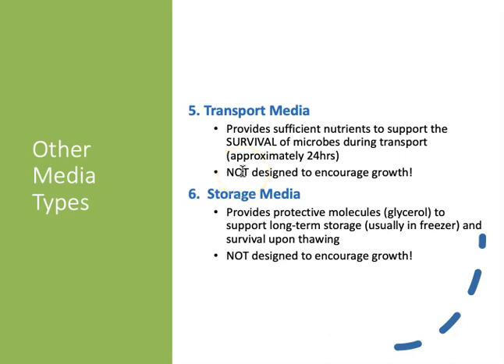There's just enough nutrition inside the transport media to keep those cells alive for about 24 hours. We don't want those cells to grow. We don't want them to multiply on the way to the laboratory, because then it will appear as though there were more cells in that patient's wound or in the back of that patient's throat than there really were.